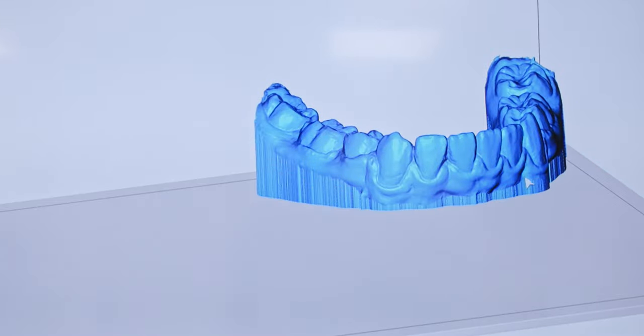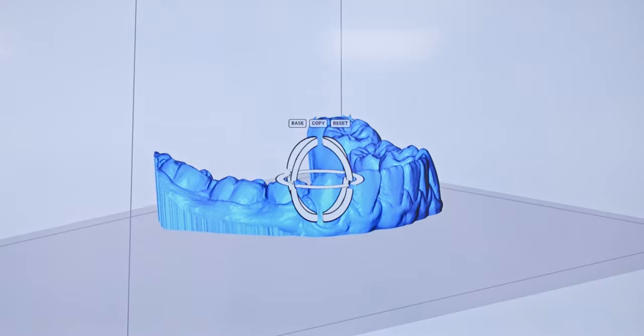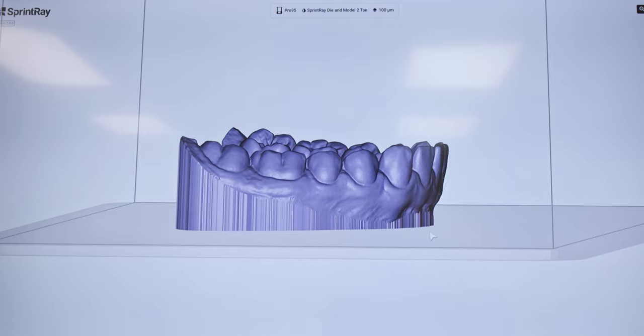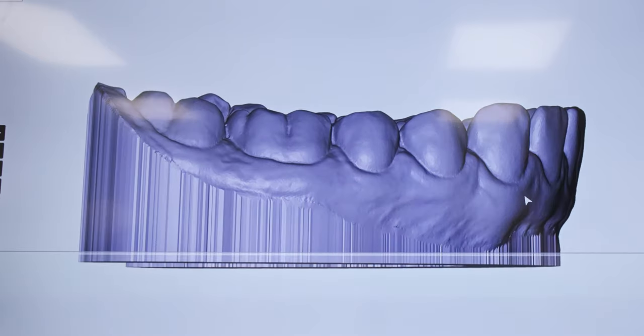We're going to say okay to that. Now the model is sitting on the build platform and the anterior and posterior teeth are on the same occlusal plane. On this next model, if you look at the anterior area right underneath the central incisors there's a gingival undercut — I'm going to blow that up so you can see it better.